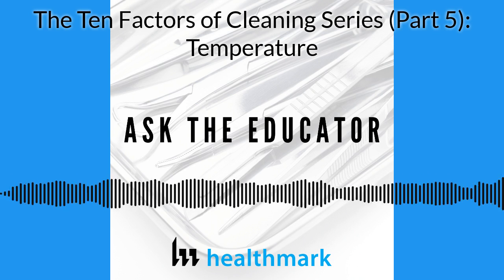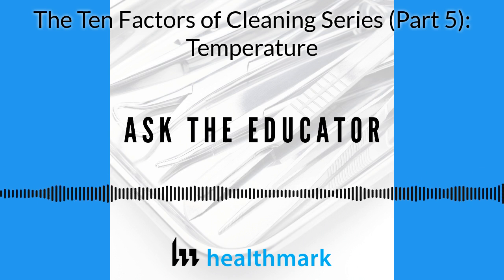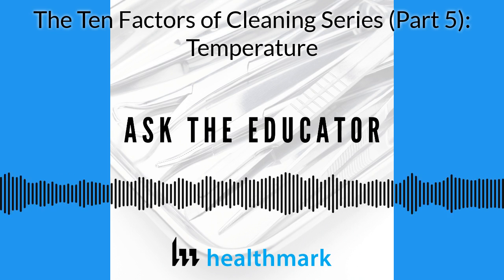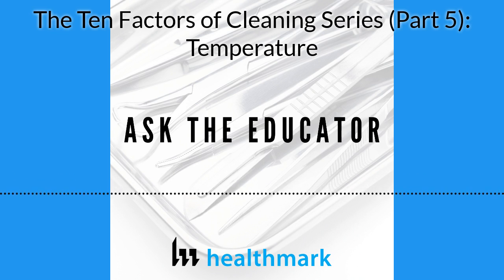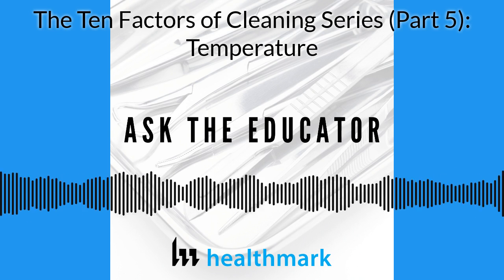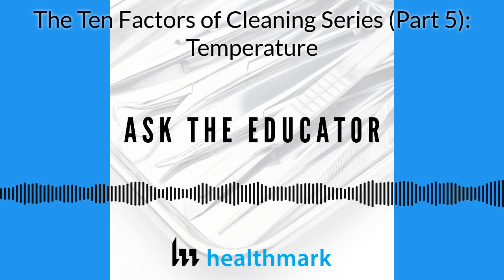But that being said, it's also one of those items that we should be monitoring within the automated washer, because just because they're automated doesn't mean they're always working, as we know, and we can't see or feel that water. So it's something that we really need to be checking in on and making sure that it's working appropriately.